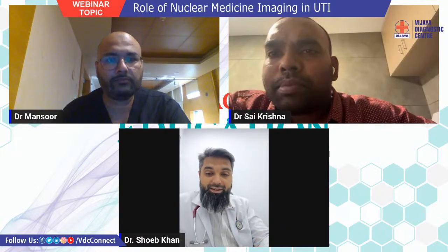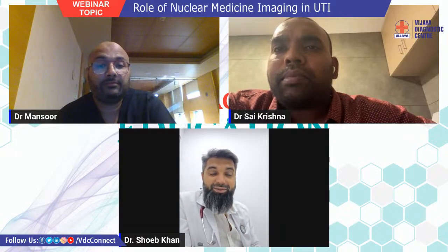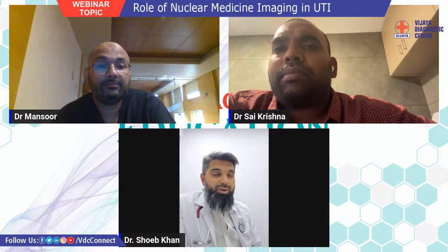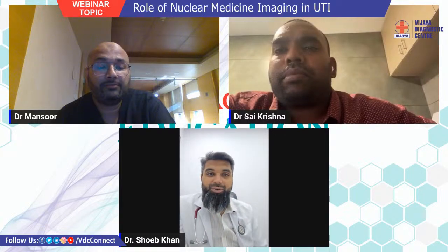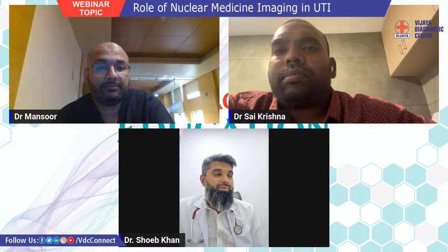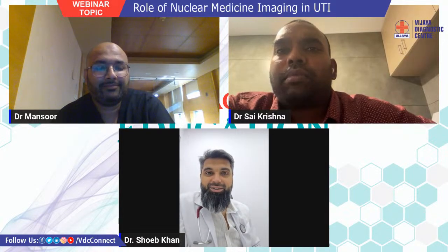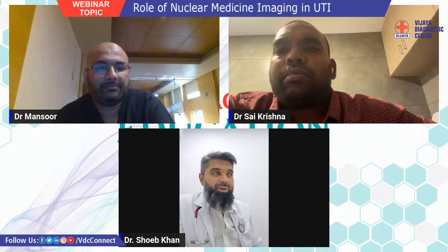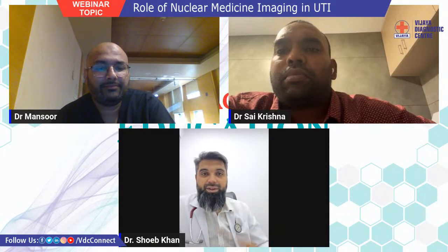and I got to know a lot of new things. Most importantly, that 100 times reduced radiation in DRCG is a very useful thing. So probably for somebody who gets a UTI, the standard of care is to do an MCUG, look for reflux, and follow up annually. That's the guideline. Annual MCUG is done till the reflux has burnt out or till the age of at least 12 years, if symptomatic UTI is there. But I think DRCG is a lifesaver. It can reduce the risk of cancers in the future.